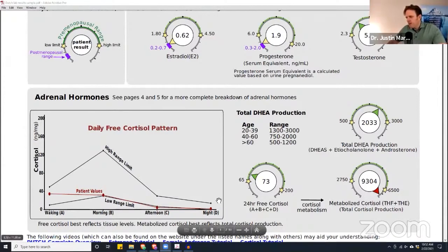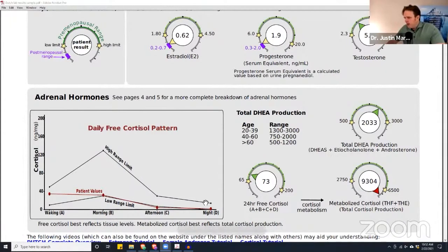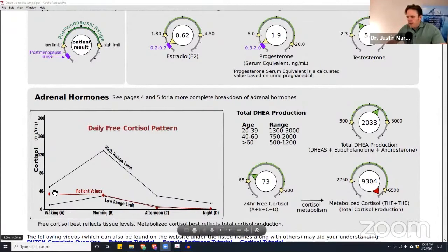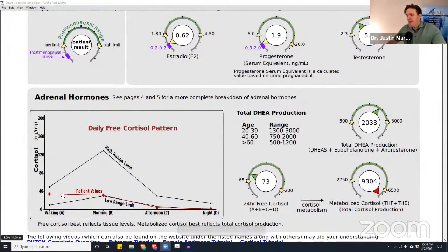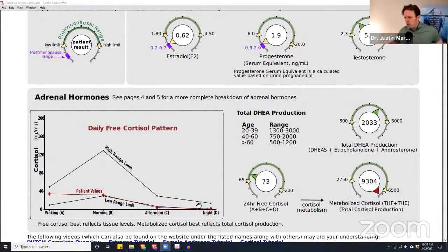So we call this a flat cortisol rhythm. Relatively speaking, it's flat — they should be starting here at A, peaking up at B, and then gently tapering down throughout the day. But they basically started at A at their highest point and went down throughout the day. So a very low and flat cortisol rhythm.